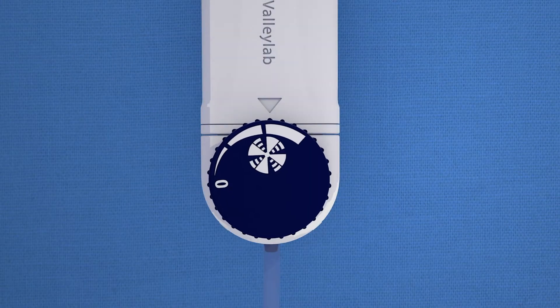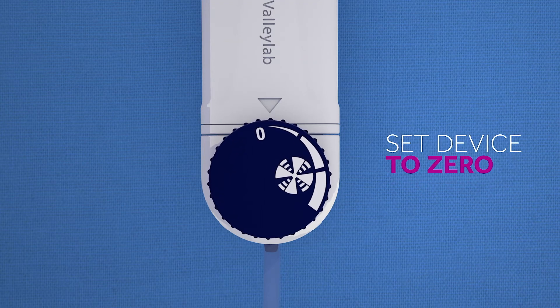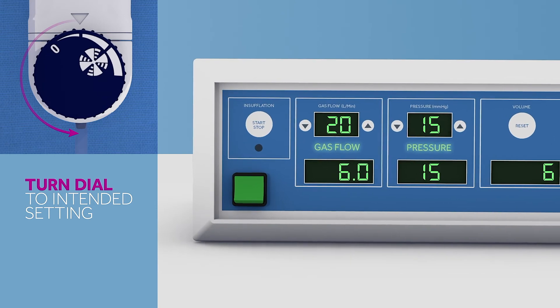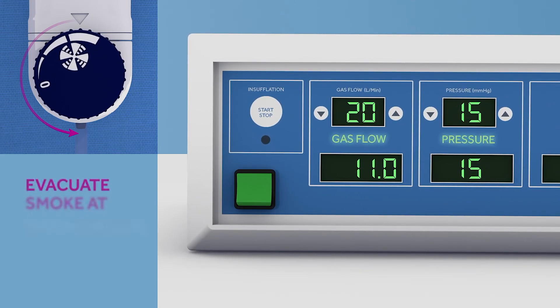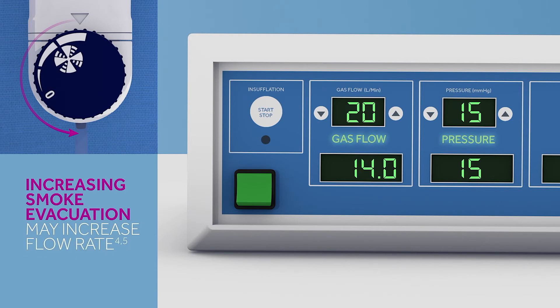To get an idea of how the device impacts gas flow levels on your insufflator, start with the device set to zero. Now turn the dial of the ValleyLab Laparoscopic Smoke Evacuation System to your intended setting. The device is designed to evacuate smoke at a maximum rate of 14 liters per minute. As you increase the rate of smoke evacuation, you may notice the insufflator flow rate increasing — it is replacing the gas that is flowing out through the smoke evacuator while maintaining the set pressure.